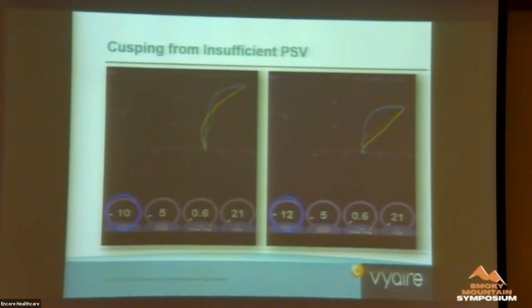This is pressure support. You're telling the patient to breathe on their own, say 10 over 5. The patient would like something bigger because they're taking bigger volumes and they're, again, trying to run away from the vent, either inside out or flatten out. Give them more pressure support.